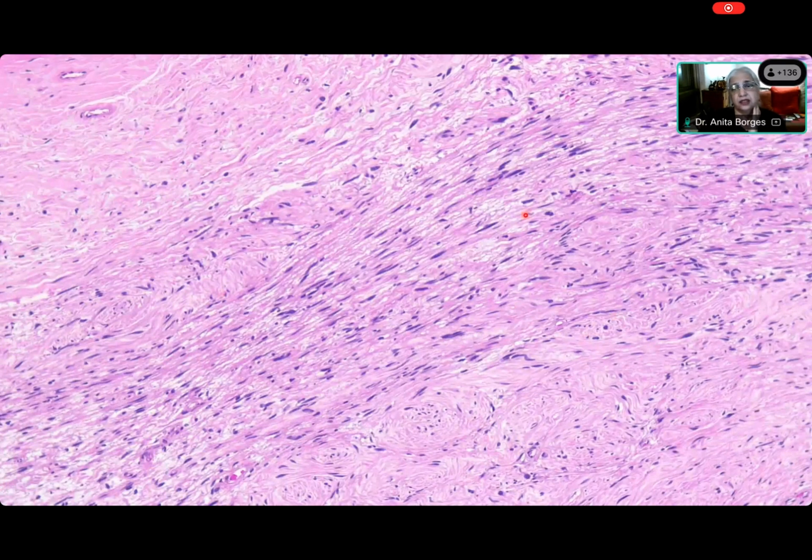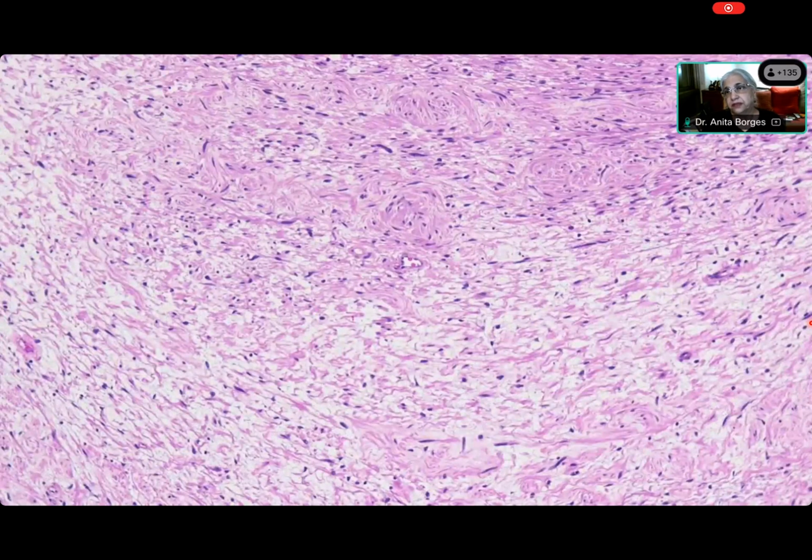No, yeah, it's a nice fascicle. But why are we calling it shredded carrot? Did you understand? You just read in the books and said shredded carrot. What is a carrot, Elsa? Wispy collagen. What is a carrot, Elsa? Have you seen a vegetable carrot ever? Yes, ma'am. What is it? A vegetable. Okay, so you know how it looks like a carrot? Yes, ma'am.